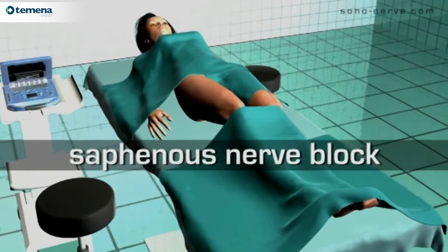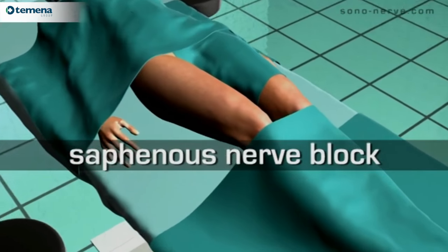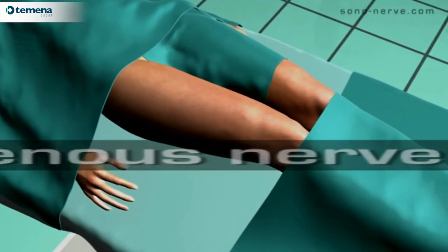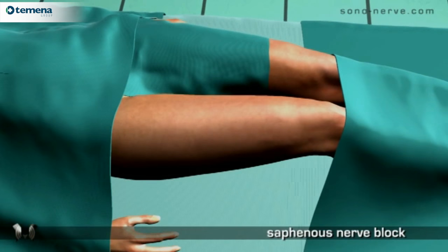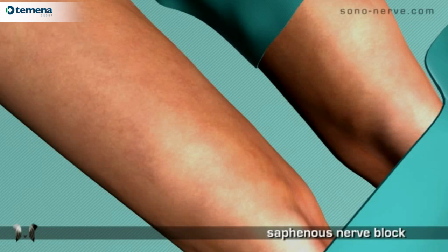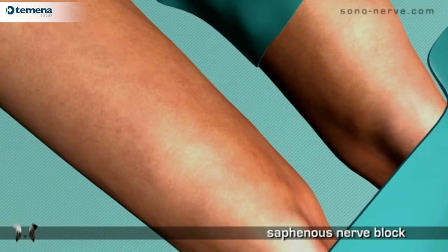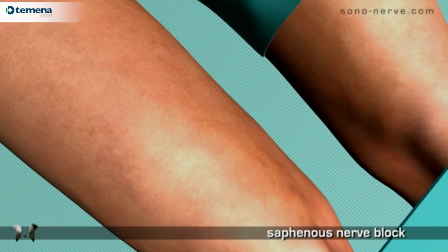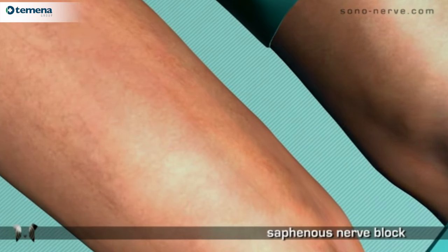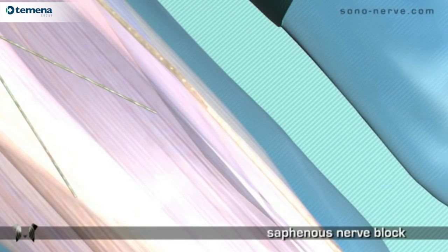The patient lies in the supine position with the leg slightly abducted and externally rotated. The saphenous nerve lies medial to the quadriceps muscle and deep to the sartorius muscle.